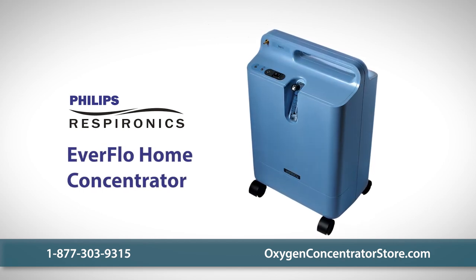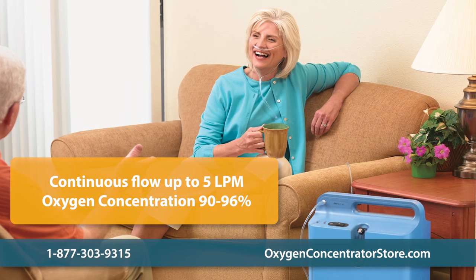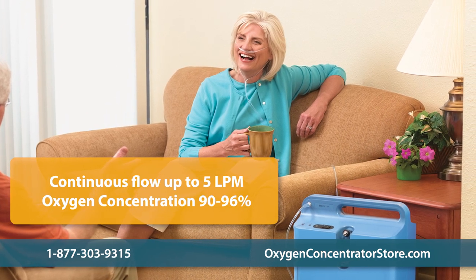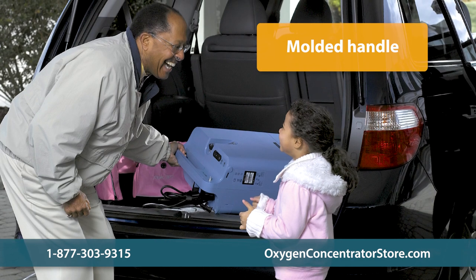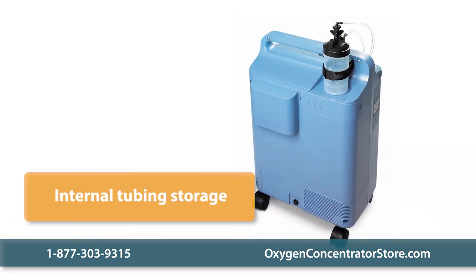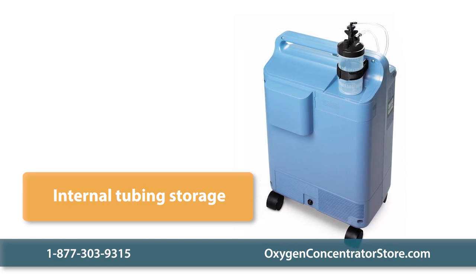The Philips Respironics Everflow home oxygen concentrator is a low-maintenance and energy-efficient home oxygen concentrator. This unit can deliver a continuous flow of up to 5 liters per minute with an oxygen concentration of 90 to 96%. The roomy molded handle and four wheels make the Everflow easy to transport, and an internal tubing storage neatly keeps the humidifier bottle tubing available for whenever you need it.